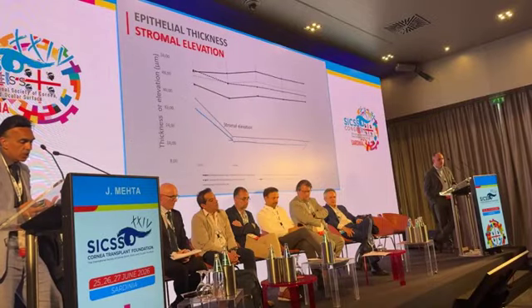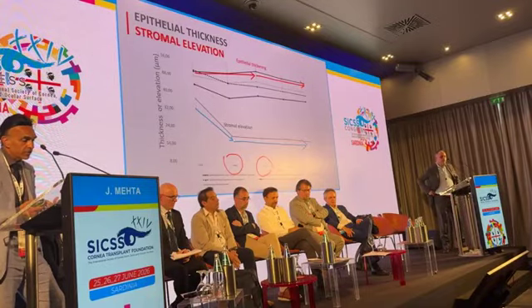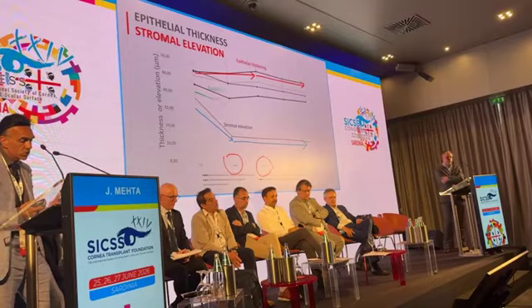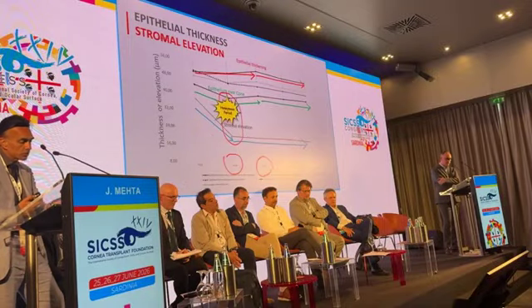Now when you study the epithelium, there will be some epithelial remodeling over the area of the segment and over the area where the segment is not as well. So it's important to look at the differences. If you chart this over the area and you look at stromal elevation divided by epithelial thickening, you'll see there is a thickening and remodeling over the area where the segment is, and a slight depression in the stromal elevation. This is normally stabilized by one month.